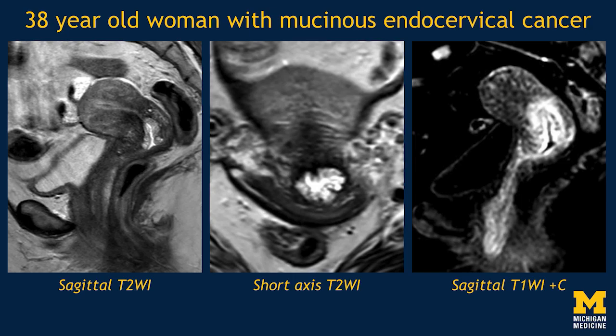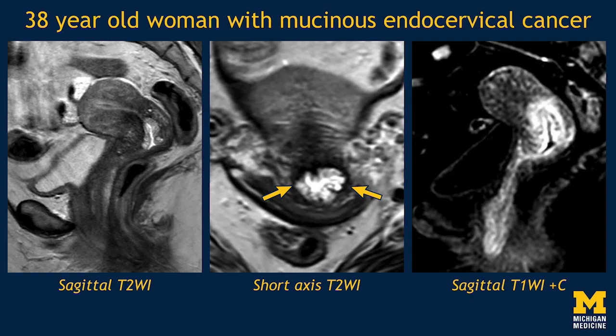Here's one patient who has more of a mucinous-type endocervical cancer. We've all seen nabothian cysts in the cervix — those mucinous glands that become obstructed and become quite enlarged in some cases — and they can be tough to distinguish from mucinous endocervical cancer. But I would look for soft tissue that enhances and for intermediate or gray signal rather than pure fluid signal you might see in something that's just mucinous. We can see a tumor here with a kind of polypoid appearance that's actually just multiple locules of mucin, and we can see that the whole thing was hyper-enhancing.